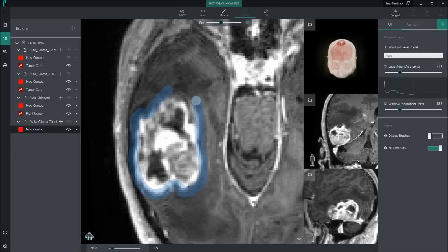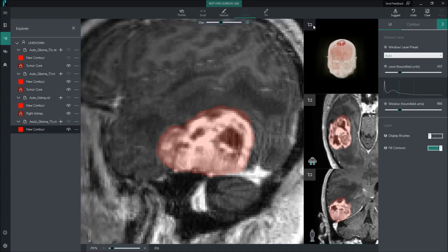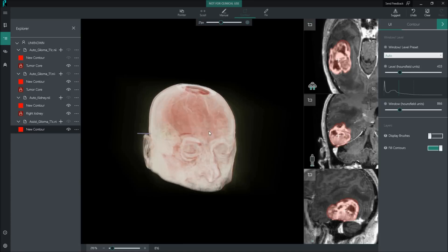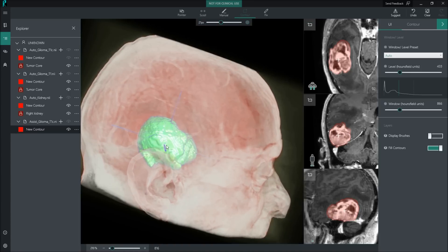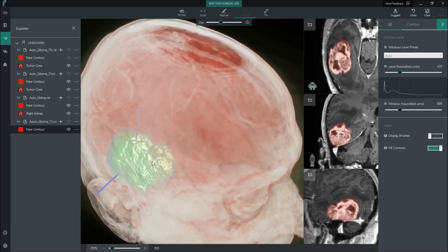Here is an example. I am just providing, in two horizontal slices, some hints of where the tumour should be, and as soon as I release the mouse, the full 3D segmentation is obtained accurately for us, while the expert maintains full control over the process at all times.